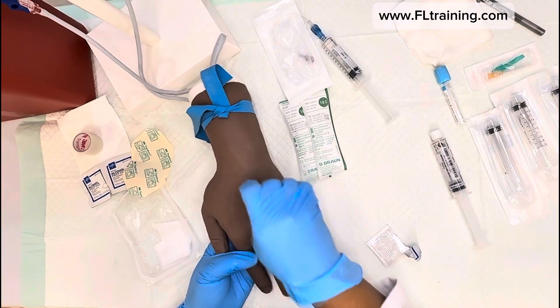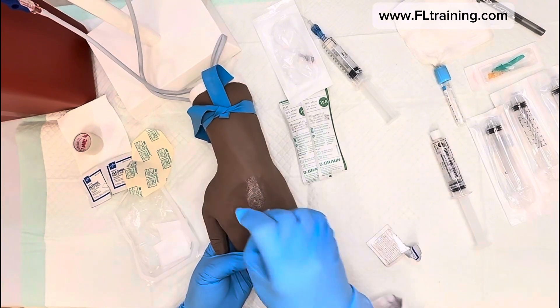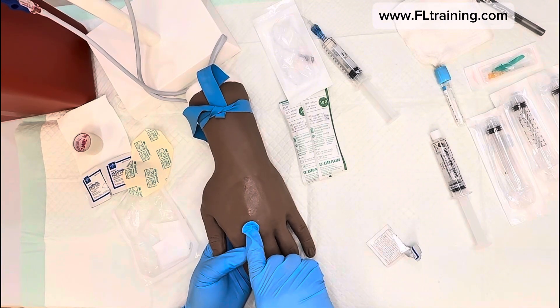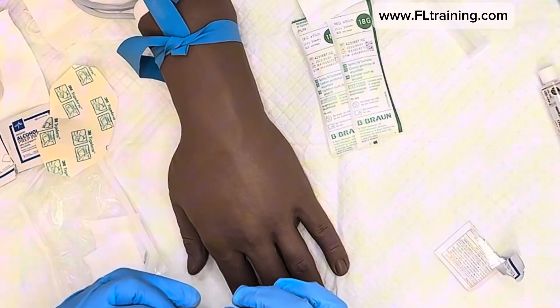Now I'm going to clean. When cleaning the skin with alcohol, use circular motions for about 20 seconds. With chloroprep it's back and forth for about 30 seconds. A good technique: while the area is still moist, you can really visualize that vein. Keep the alcohol gauze pointing toward the vein.